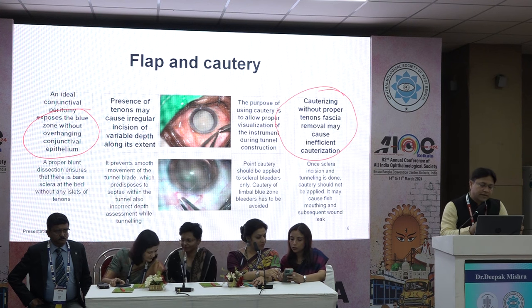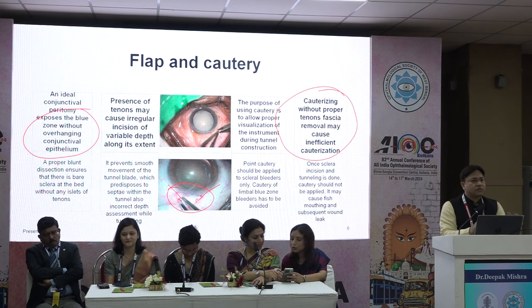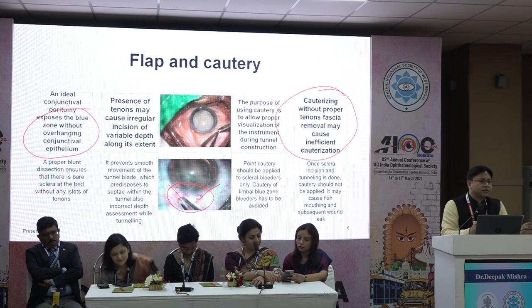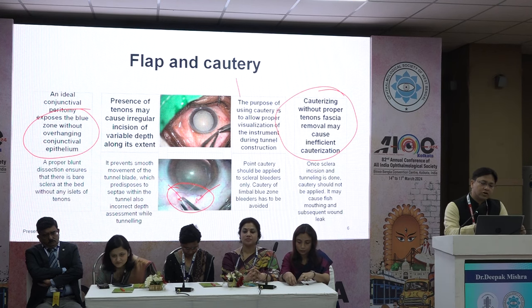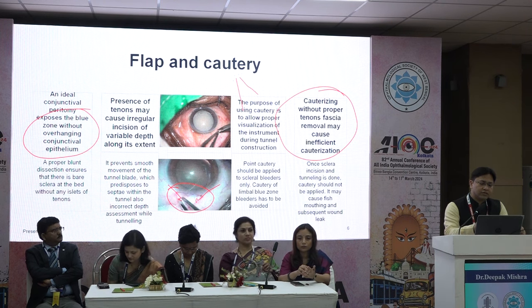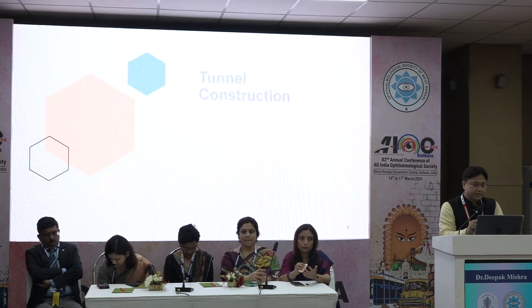But if you are using this type of cautery, meaning wet field cautery, then make sure that your assistant is not spreading a lot of water. It is not required. It's just a drop of water. Our cautery tip is like that. Don't close it. If it is open, the current flows from right to left and left to right, and that will help in the cauterization. Don't close it.